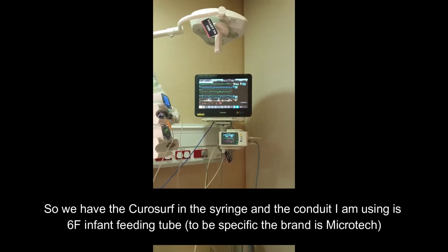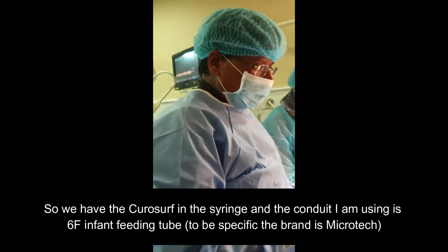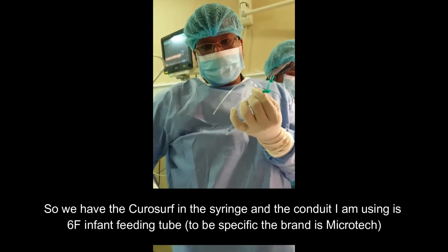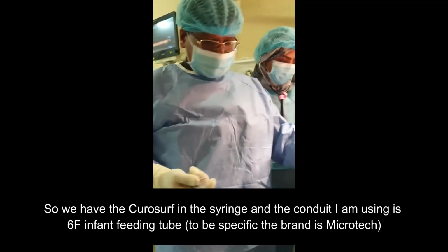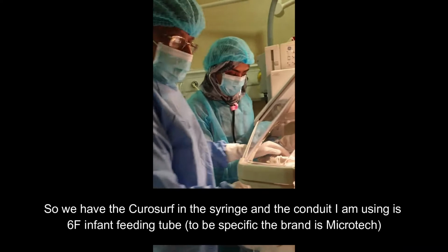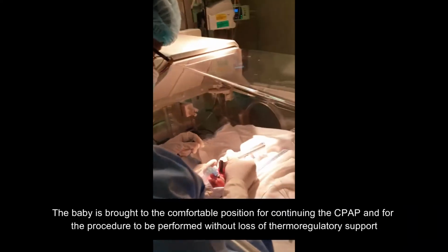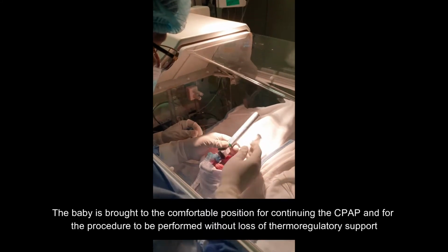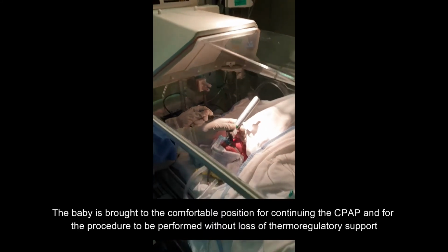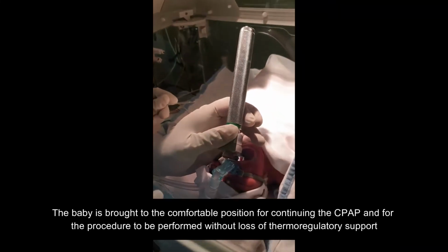So we have the Curosurf in the syringe. See that substance, Curosurf, and the conduit I am using is a 6 French infant feeding tube. To be specific, the brand used is Microtech. The baby is brought to a comfortable position for continuing the CPAP and for the procedure to be performed without the loss of thermoregulatory support.